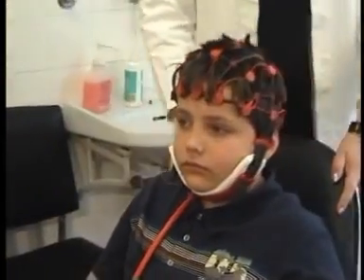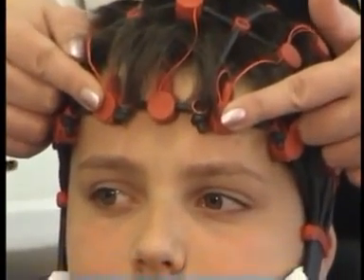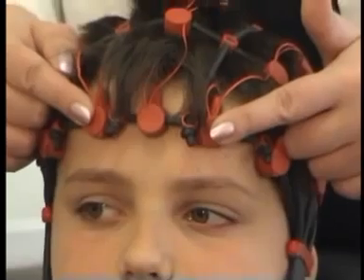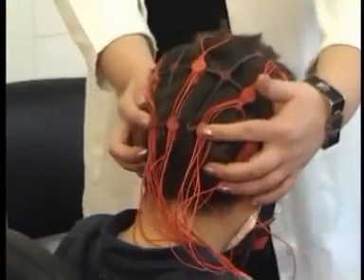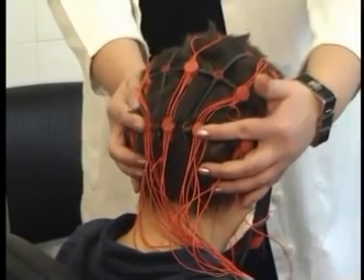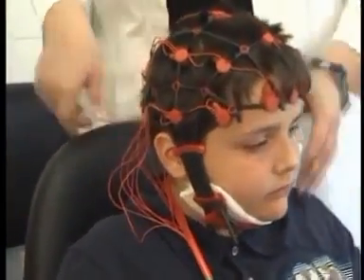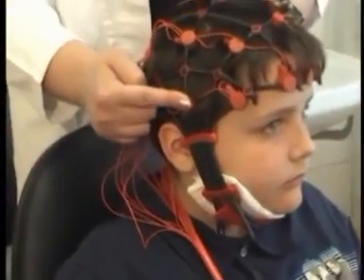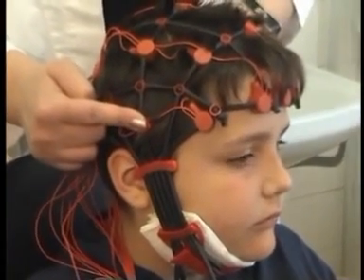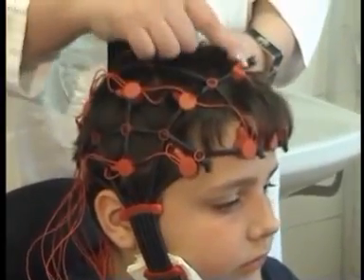Place the cap so that the frontal electrodes are on the 10% of the distance of the nasion-inion line above the eyebrows in the middle of the forehead. Occipital electrodes are also placed on the 10% marker of the same line, but measuring from inion to nasion. The central temporal electrodes are placed on the 10% of total length of the transversal line, measuring from one preauricular pit to the other. The remaining electrodes are placed at 20% length of the aforementioned lines from each other, which is common knowledge to most EEG technicians.